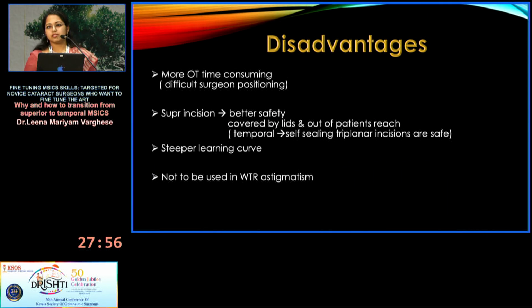Now, what are the disadvantages? It is said to be more OT time consuming just because you have a difficult surgeon positioning. You can actually compensate that by posting all your right eyes together followed by your left eyes.